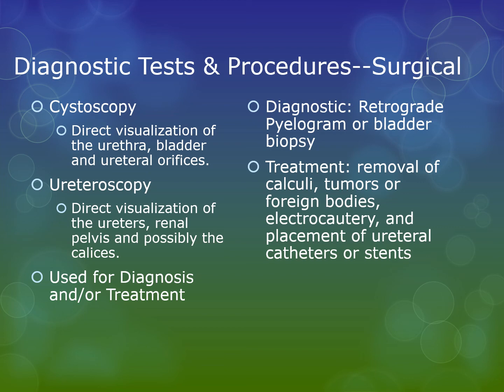You can fulgurate. If something is bleeding, okay, if they have some part of the bladder that's bleeding, you not only diagnose the source of the bleeding of the bladder, but you can use a little device that provides some electrocautery and actually fulgurates or cauterizes that bleeder. So that's another option. You don't think a whole lot about foreign bodies in the bladder, but I'm just telling you, that happens. And so we can also do some foreign body removal with the cystoscope.